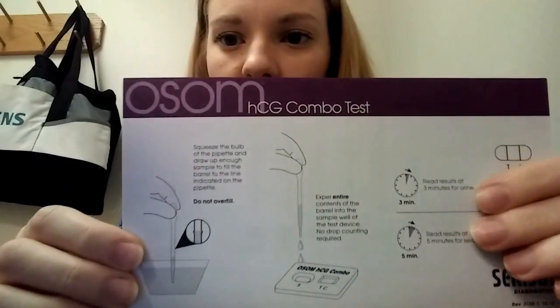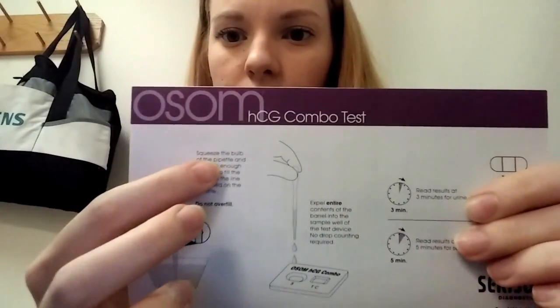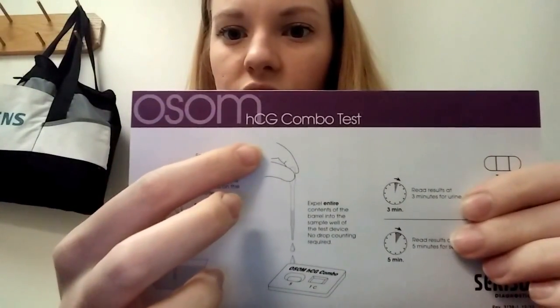Hey guys, it's Mara and today I want to talk to you about the principle behind urine pregnancy tests or serum pregnancy tests, because both urine and serum can be run on these types of tests. This is the test we use in the lab. This is the package insert that comes with it — it's called the OSOM hCG Combo Test.